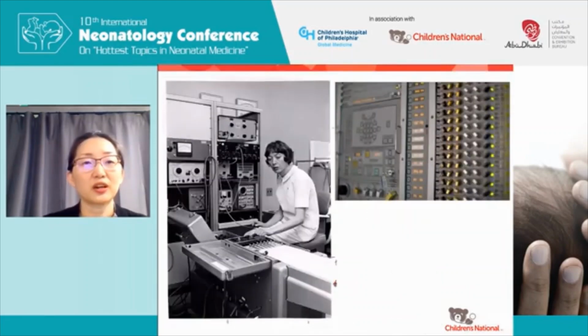This is a picture of the very first EEG. And as you can see, this is not a device that is going to be moved to the patient. The patient is going to go to the EEG device.